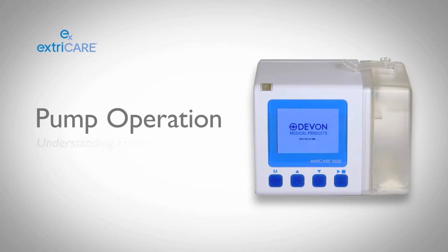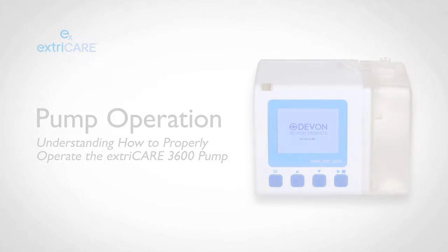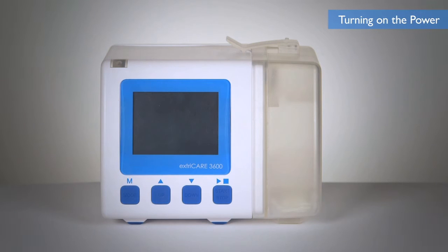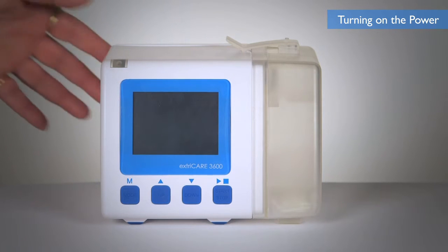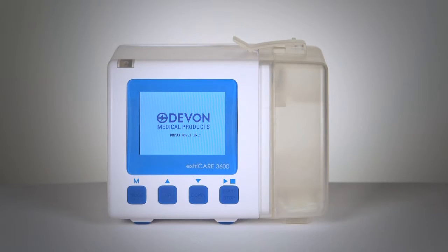Please follow along as we take you through the different steps on how to operate our ExtraCare 3600 pump. To turn on the ExtraCare 3600 pump, flip the power switch located on the back panel of the device. The screen will display the starting image and the system will complete a self-check. After the self-check, the device will display the standby screen.